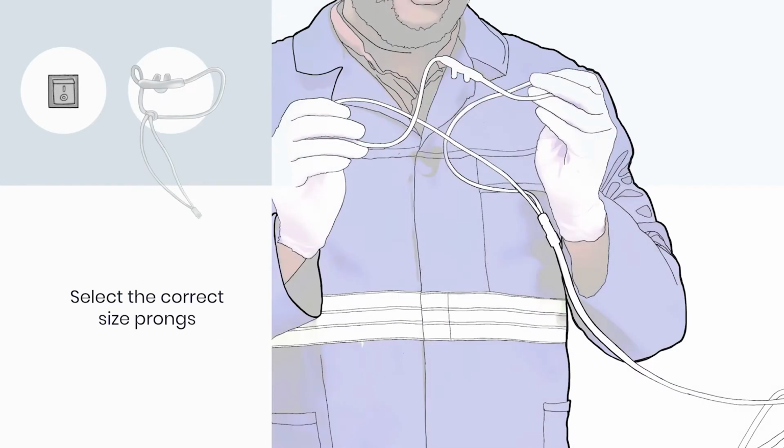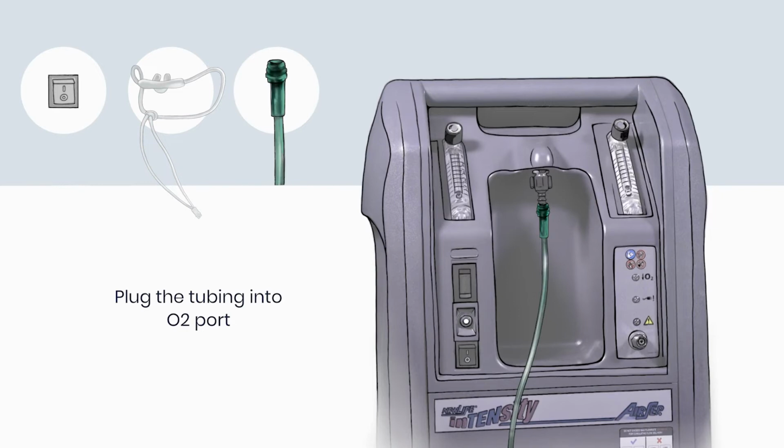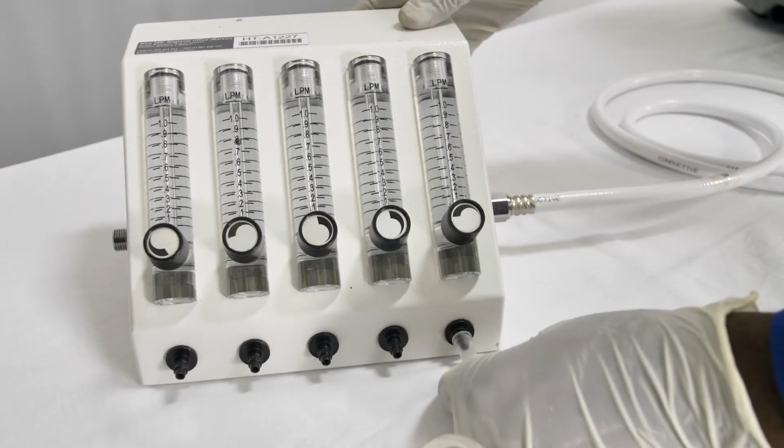While the machine is warming up, you can choose the correct size prongs for your baby. For oxygen prongs, you do not need to completely fill the baby's nostrils. They should only fill about 3/4 of the nostrils. This is so that the baby is still breathing in some air with the oxygen. So this is different from CPAP, where we need the prongs to fit very snugly to be able to create positive pressure. Plug the tubing with the prongs into the oxygen port.